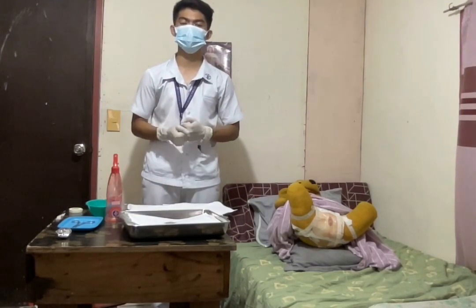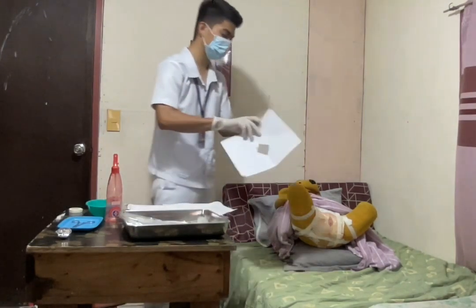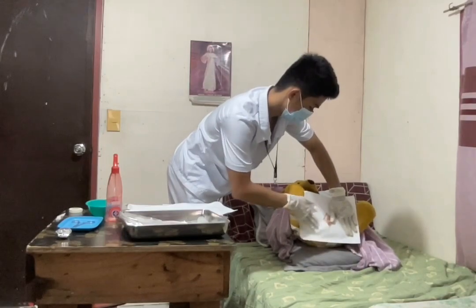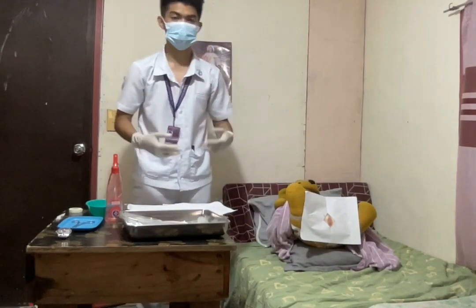Next, I'm going to put the eye sheet. This is to maintain the sterile environment while protecting the patient's privacy. Ma'am, I'm going to put the eye sheet in your perineal area. Thank you. And next, I'm going to hang the catheter bag.